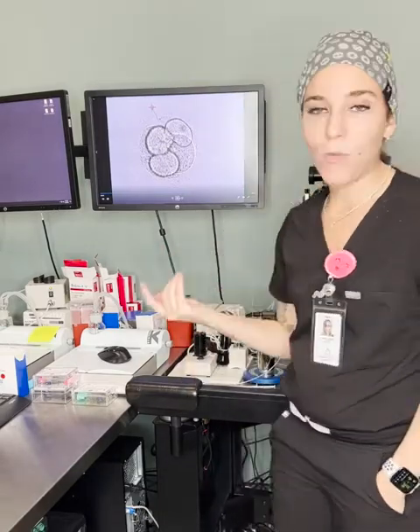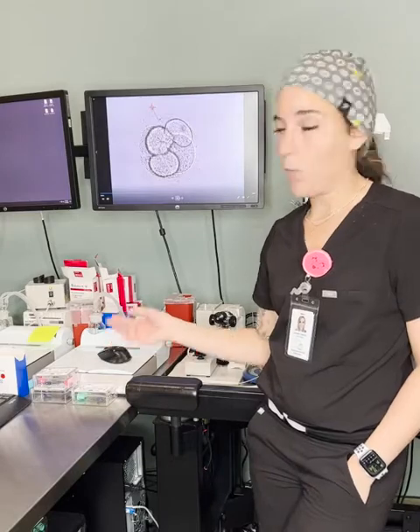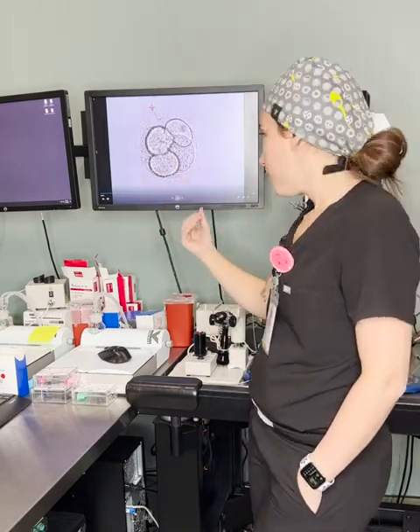Or if somebody's having a day 3 transfer, sometimes we hatch anyway, just to up your chances of pregnancy. Again, we don't do that if a patient requests they don't want it. However, it is not going to cause any harm to your embryo. As you can see, we pick the area with the biggest gap. So you want to be far away from the cells so that you don't risk damaging anything. Because again, if I hit the cells with that laser, it will kill a cell. So you always pick a spot that is the furthest away from cells.